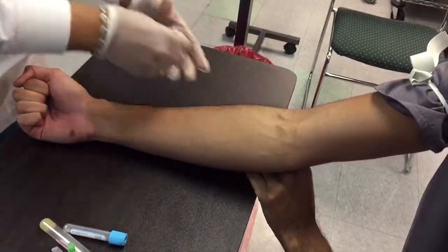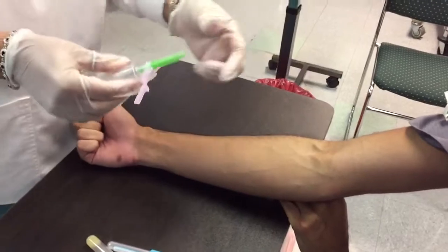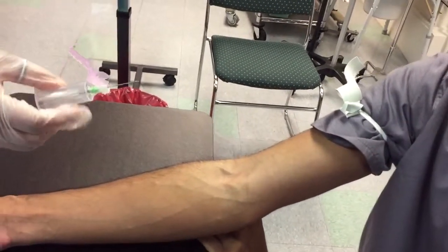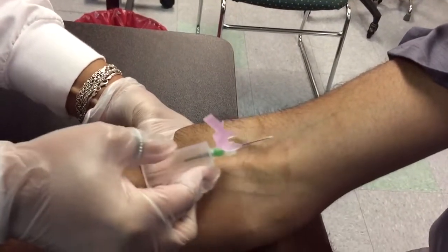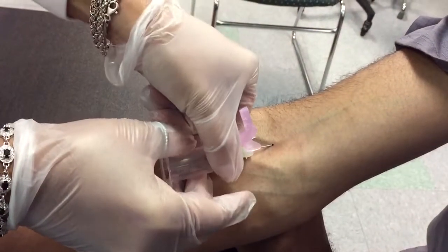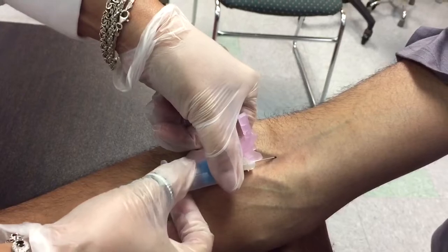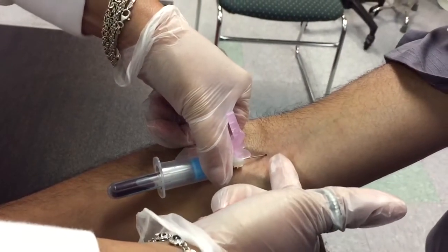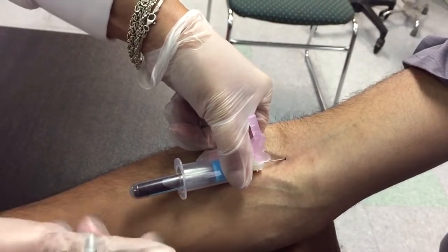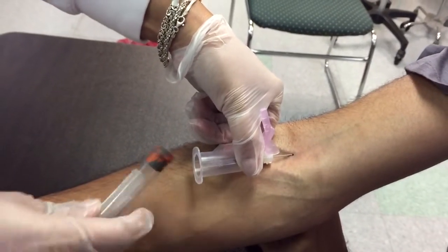I'm old school — my first concern is my patient. Make sure that the bevel is up, meaning facing the ceiling. At about a 20-degree angle, enter the skin with a quick pinch. The most important thing is to make sure your needle is in and does not move. You get your collection — full tubes. When you take the tube out, invert it.